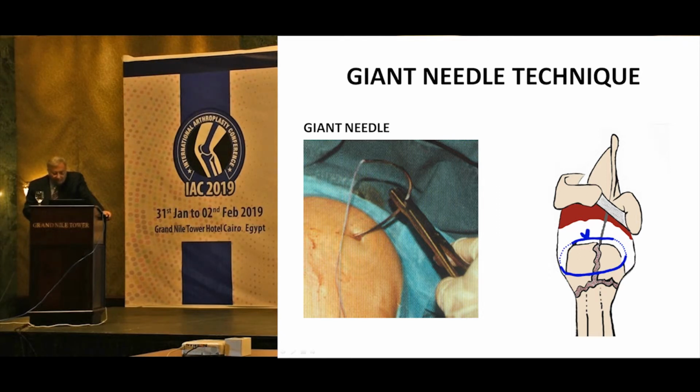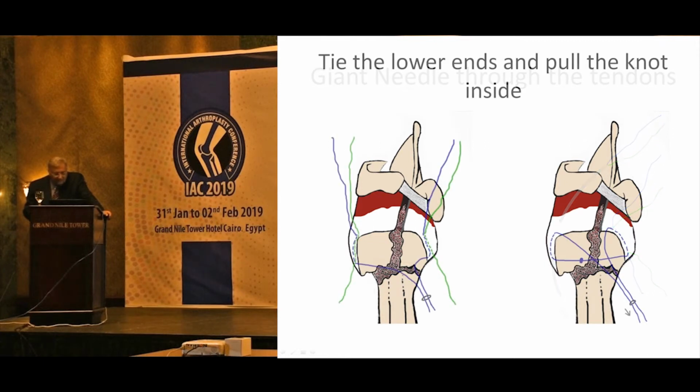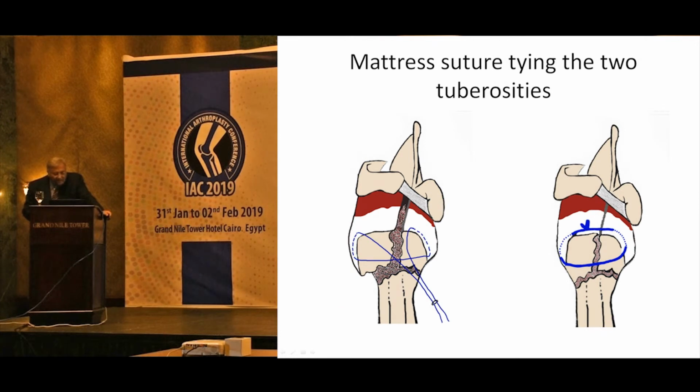We use the giant needle to adapt the 2 tuberosities together, first by passing suture through the subscapularis, and then suture through the infraspinatus and part of the supraspinatus. Then we pull the lower end of the suture through the arthroscopic portal outside, and make a knot and push it inside. Then we pull the upper end of the sutures and tie the 2 fragments, so we have a really good compression of the 2 fragments by using this technique.